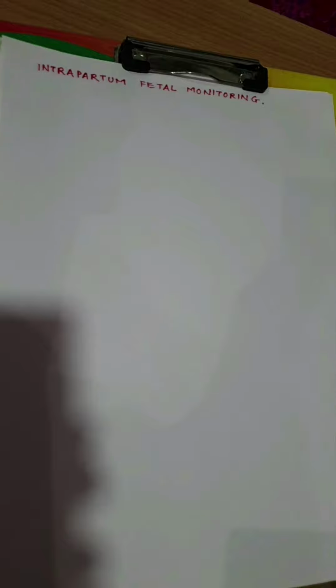Hello everyone. Today we are going to learn about the topic intrapartum fetal monitoring. Now what is intrapartum fetal monitoring? Intrapartum itself defines something that is going on in the process of labor. So what is intrapartum fetal monitoring? We simply keep a watch on the fetal condition when there is a process of labor going on.